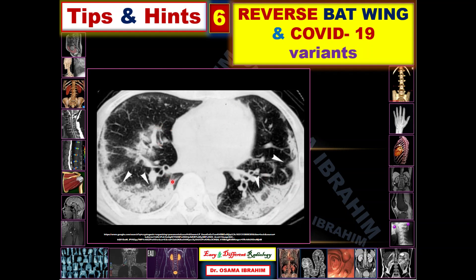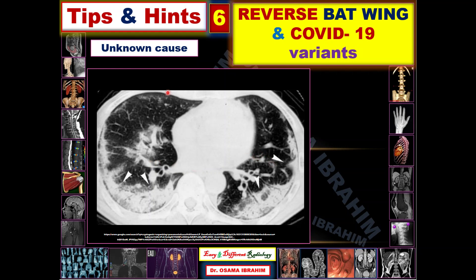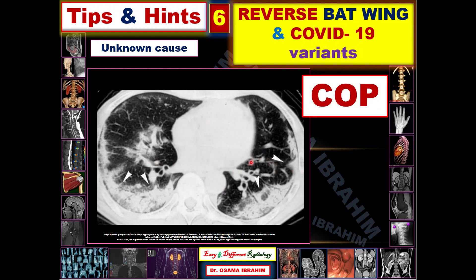Now let's start practice. This is a CT examination — HRCT lung window — showing abnormality in the periphery of the film. It is in subpleural locations, peripheral, and sparing the perihilar region. Even if there are associated perihilar findings, the main pathology is the peripheral consolidations. If you have an unknown cause and the patient has a chronic status, you can diagnose this as COP — cryptogenic organizing pneumonia — until proven otherwise. This case was diagnosed as cryptogenic organizing pneumonia.